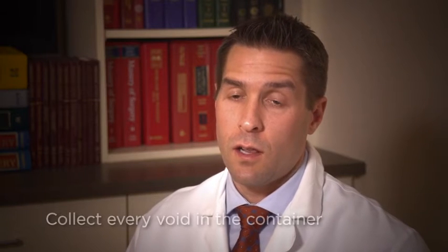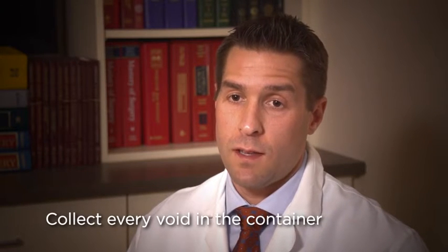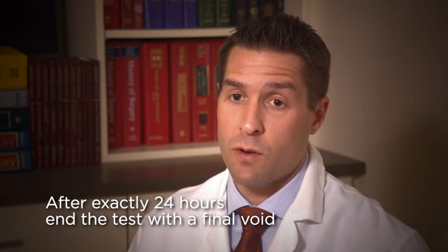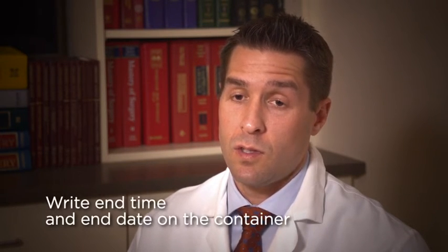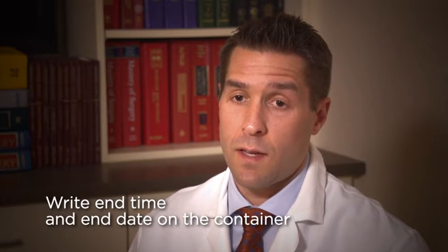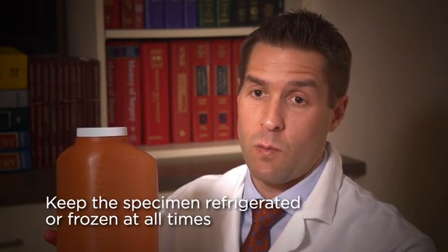From this point on, collect all of the urine from each and every void into the container. Again, even 1 or 2 missed voids will skew the results of the test. At exactly 24 hours after the start time, empty your bladder and make sure you collect this void into the container. This is the official end time of the test. Using the marker, write the end time down on the container. Next, screw the lid on tight and gently turn it over to make sure that it's not leaking. Then, hold the container upright and make sure that it's refrigerated while it's being stored.